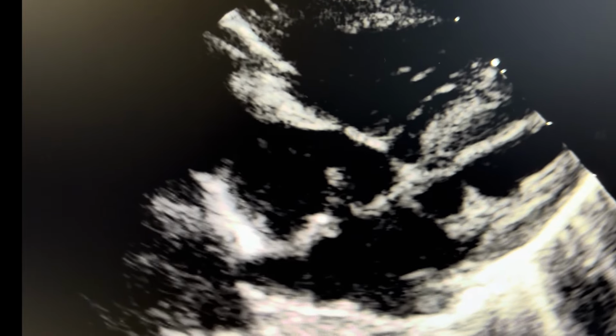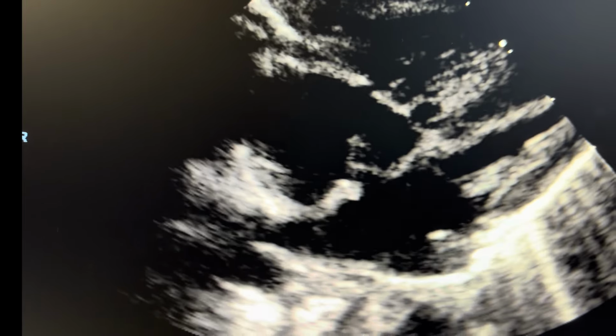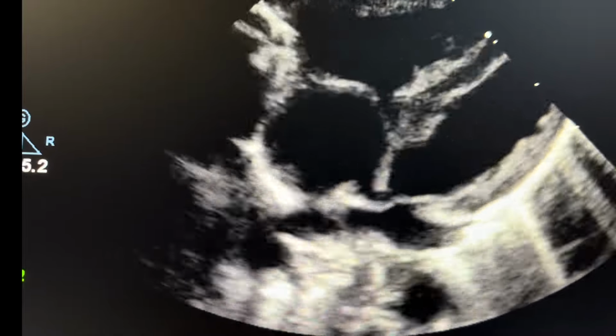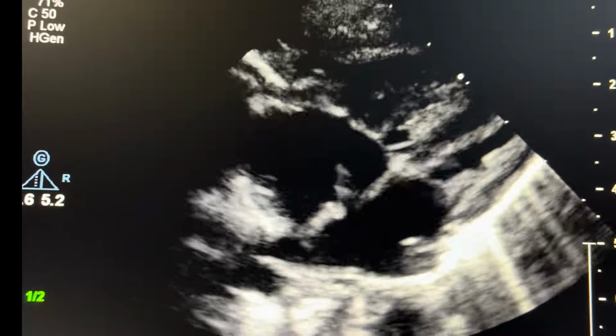You see the aneurysm bulging into the right atrium, then the left atrium, then the right atrium, left atrium. The flow here is bidirectional. You can easily appreciate it here. This is the aneurysm in the left atrium and right atrium. You know that some amount of blood mixing must happen for the child to survive in case of transposition of the great arteries.